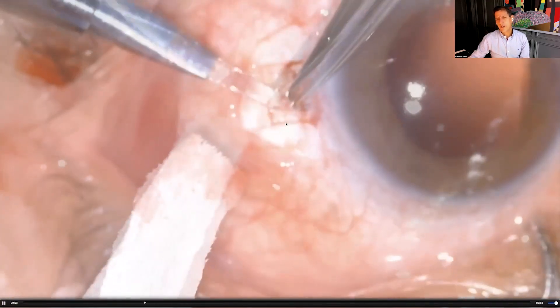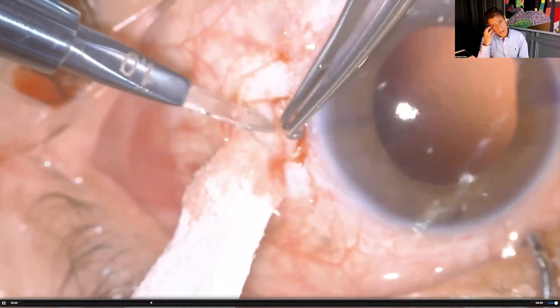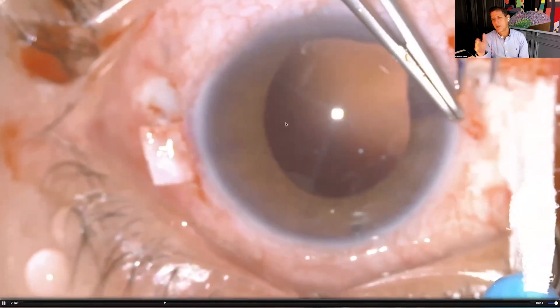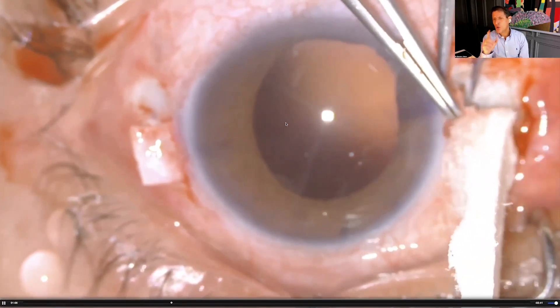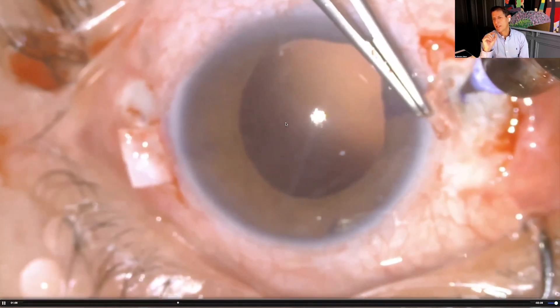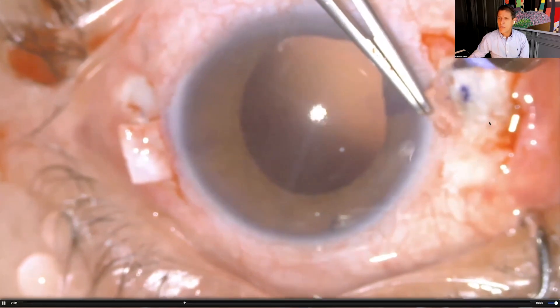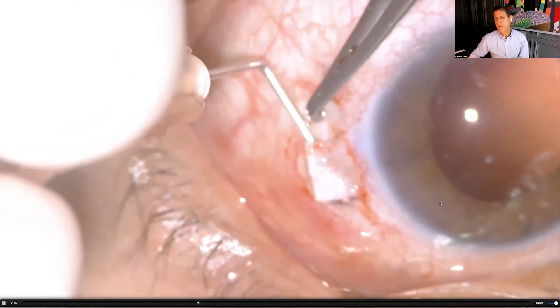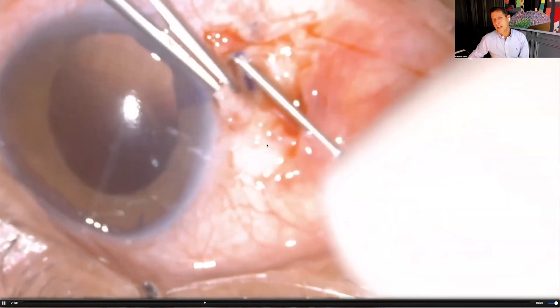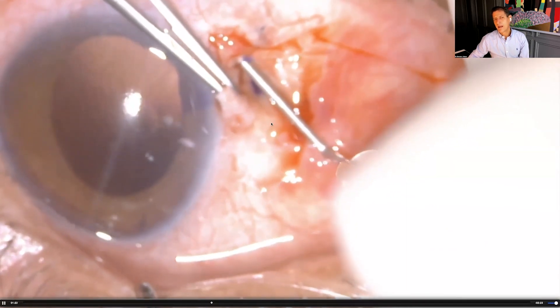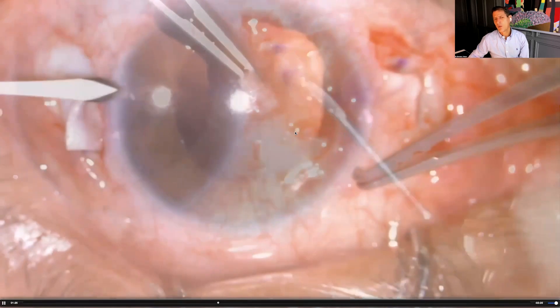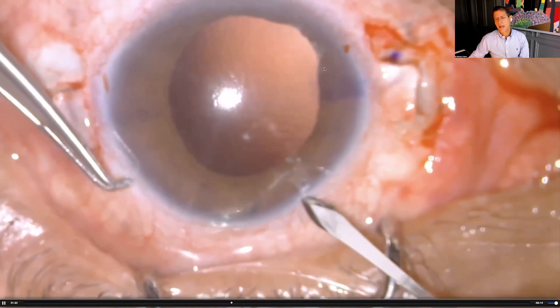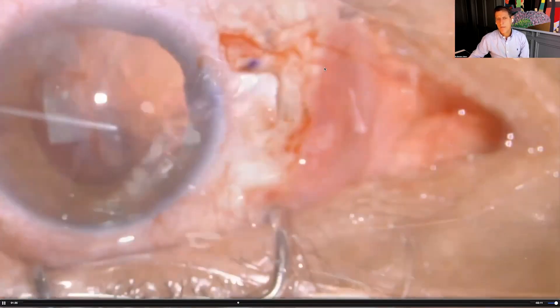It is very important to mark the corneal center so flaps are placed exactly 180 degrees apart — the lens sits without tilt because the haptics are precisely opposed. We create a 3×3 mm flap with a 15-degree, diamond, or crescent blade at 50% depth, dissecting to the limbus. We then measure 2 mm behind the limbus with a caliper, mark the edge, and introduce a bent 27-gauge insulin needle at 90 degrees to create the tunnel, followed by two opposing paracenteses.